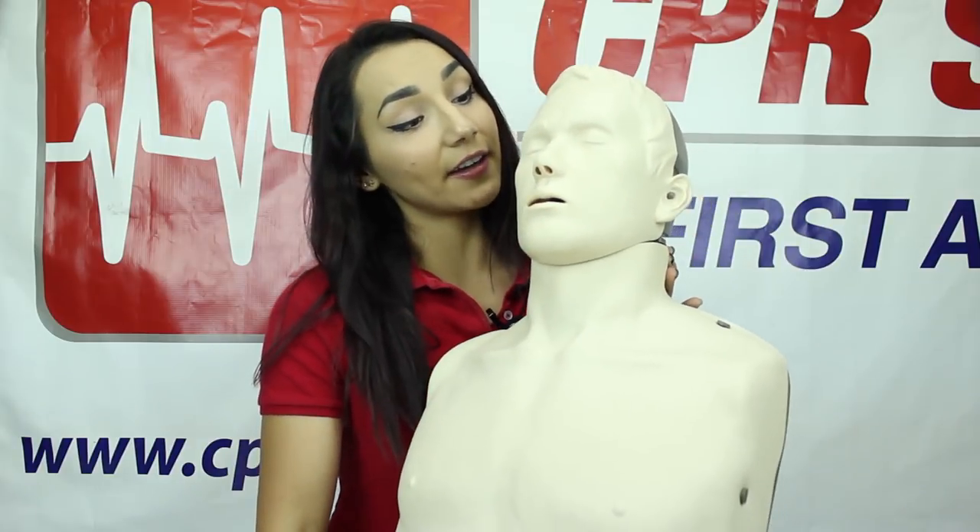Hello and welcome to CPR Savers product review. My name is Celine and today we'll be looking at the innovative Braden CPR training mannequin.